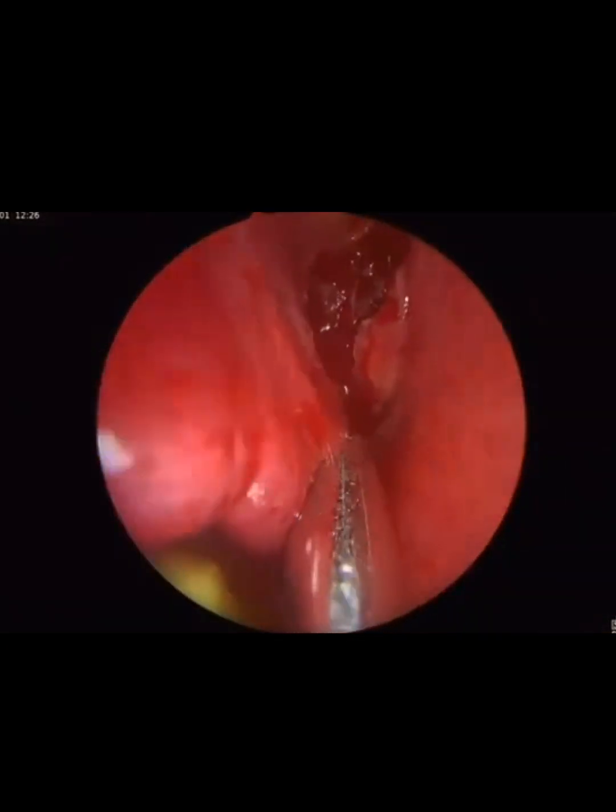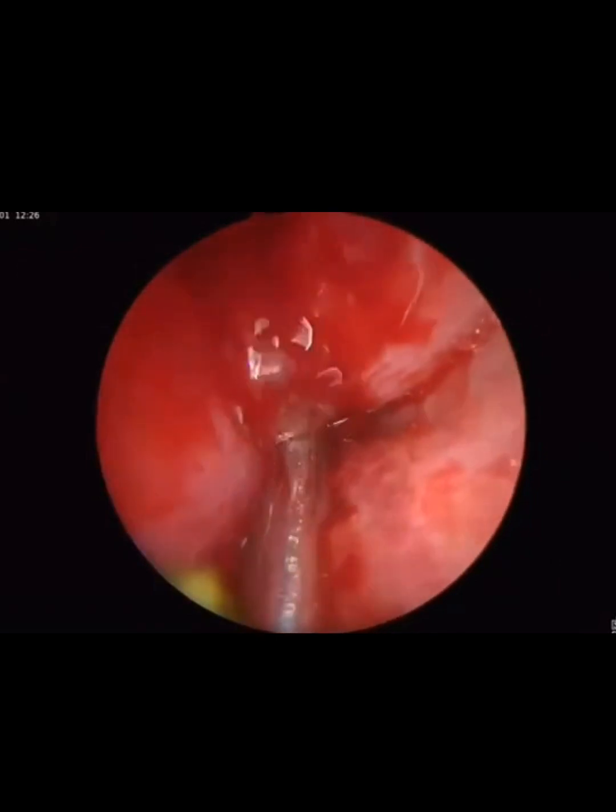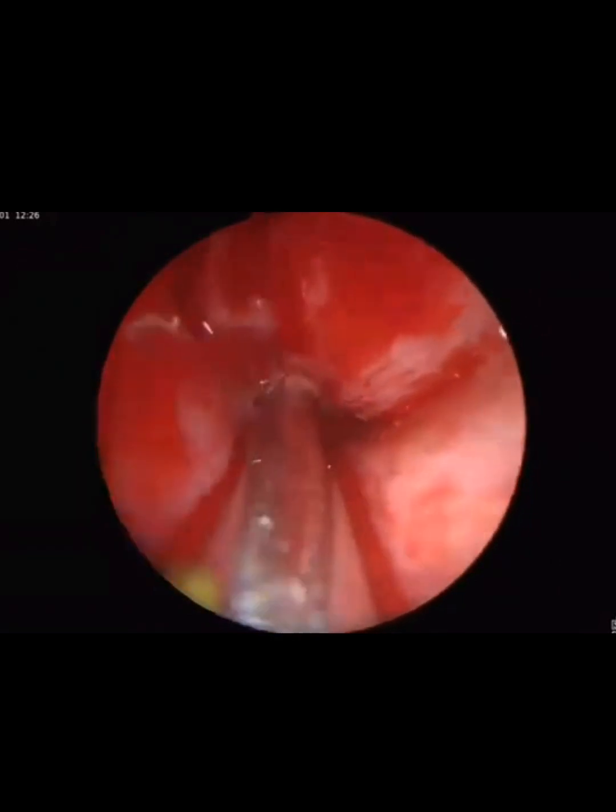Straight. Give the straight debrider first. Cord is above them. I am right now doing debulking only. Okay.